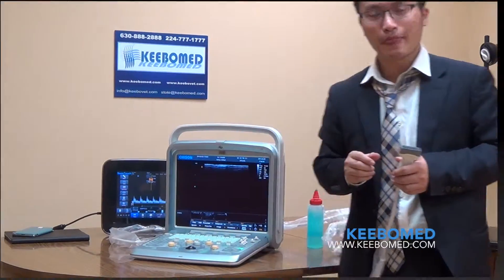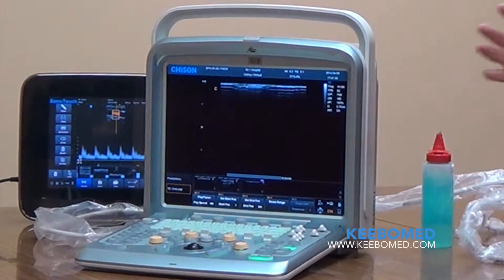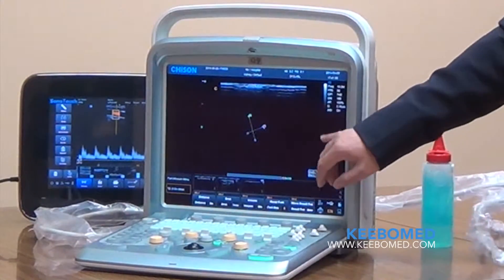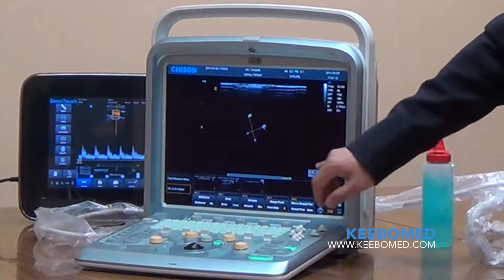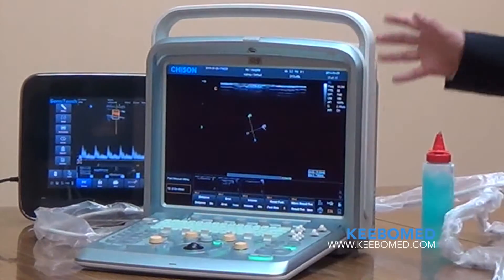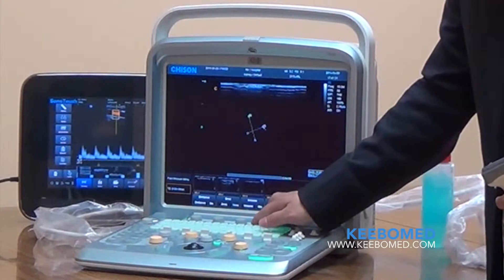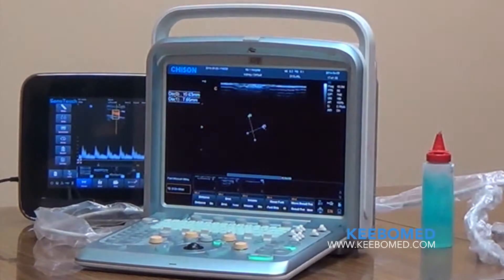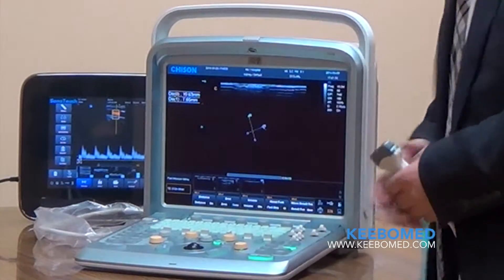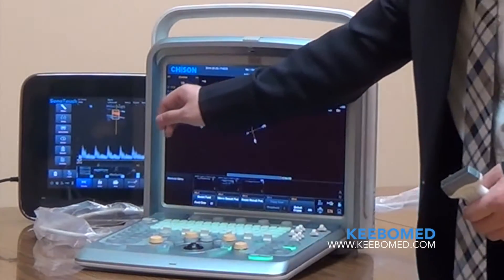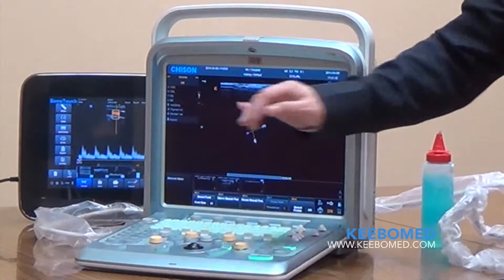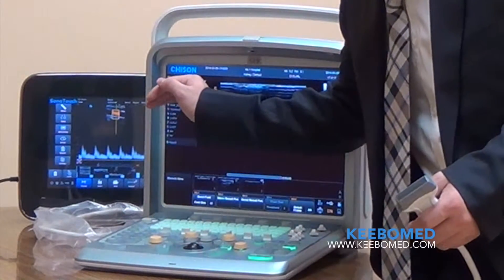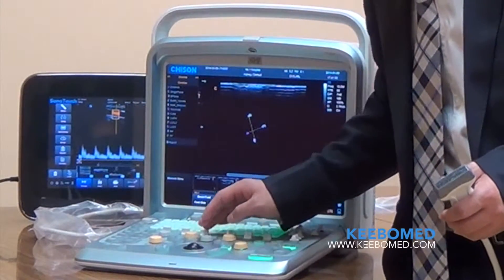This feature saves a lot of time for doctors. When we freeze, doctors can also do measurements — for example, measuring a distance and viewing the result. On the Q5, we can adjust the font size of the result, and we can also move it anywhere on screen. Additionally, we have measurement packages — special packages for different animals — with different calculation packages including cardiology and OB.